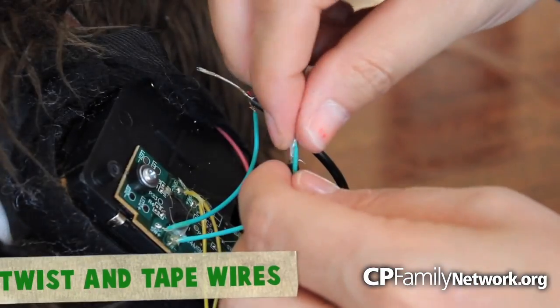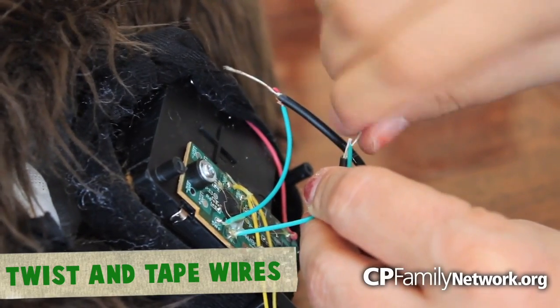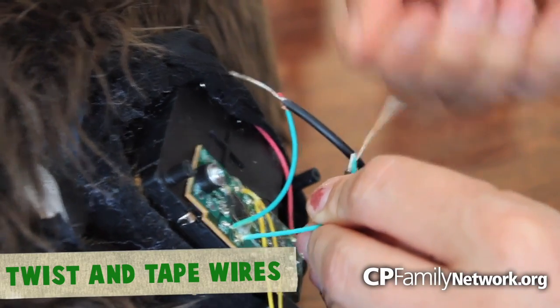Now, go to the spot on the back of the circuit board and twist the other side of the RCA cable, and also tape it as well.